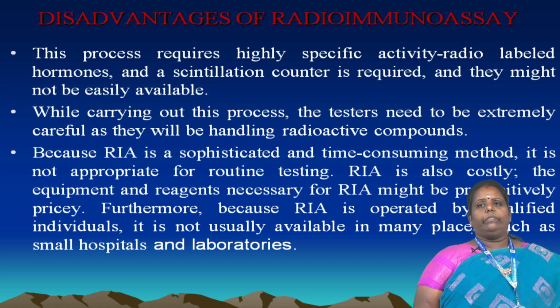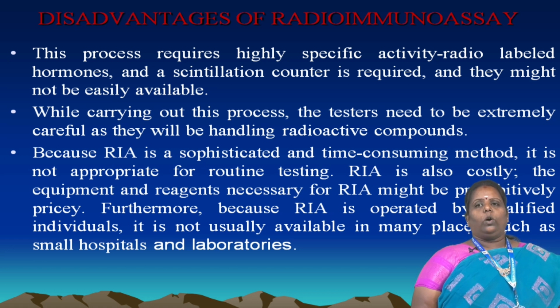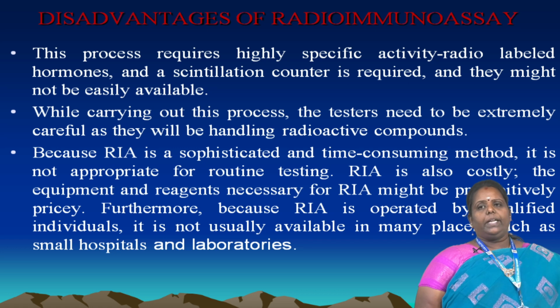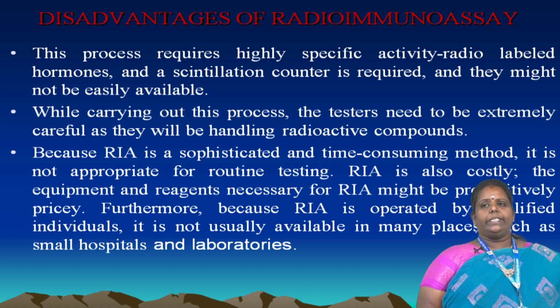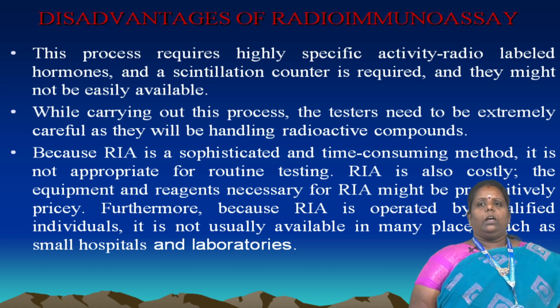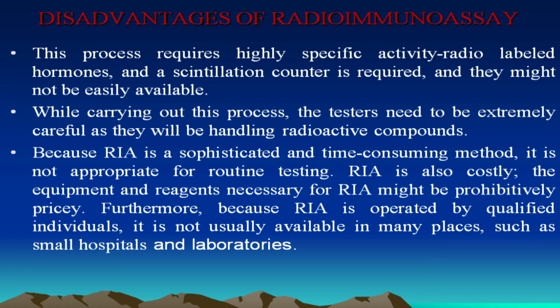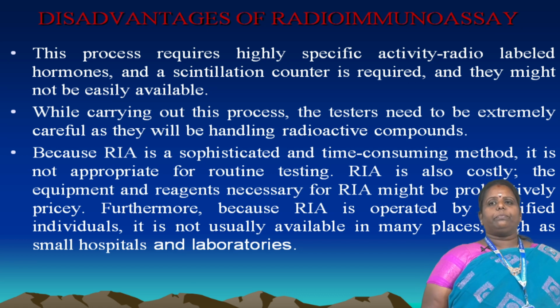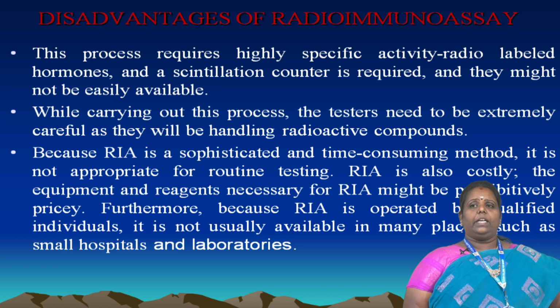While carrying out this process, the testers need to be extremely careful as they will be handling the radioactive component. The RIA technique is sophisticated and time-consuming, so it is not appropriate for routine testing. RIA is also costly. Normally, the equipment and reagents necessary for RIA might be prohibitively pricey, and the equipment and reagents are also costly.